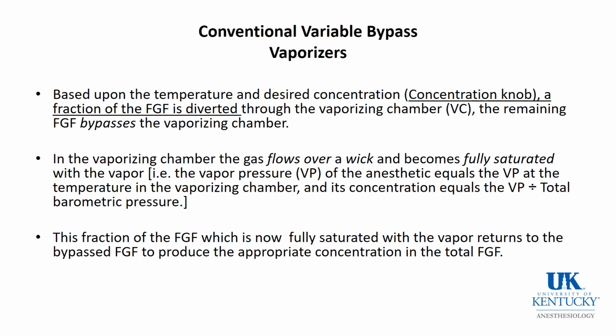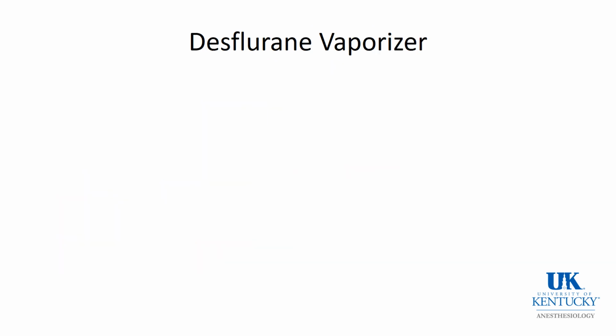These are also temperature compensated, so that within reasonable room temperature they still produce the proper amount of vapor. The second vaporizer is the desflurane vaporizer.